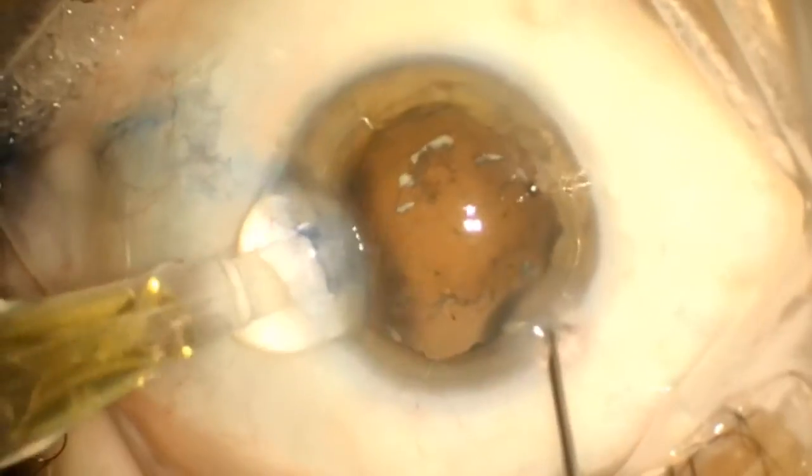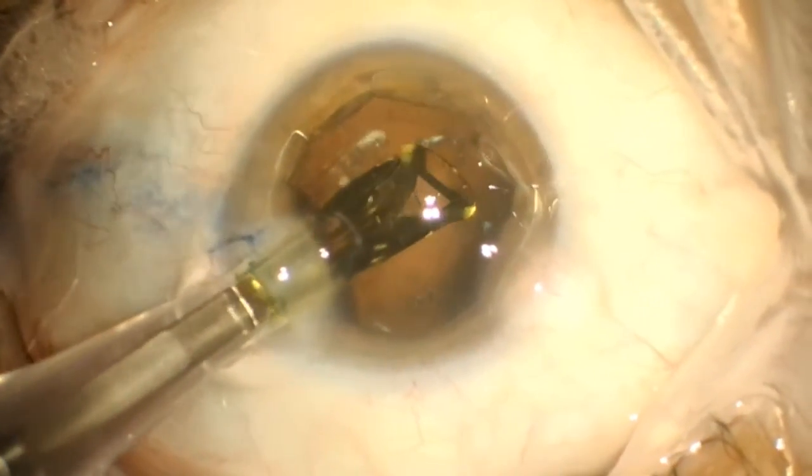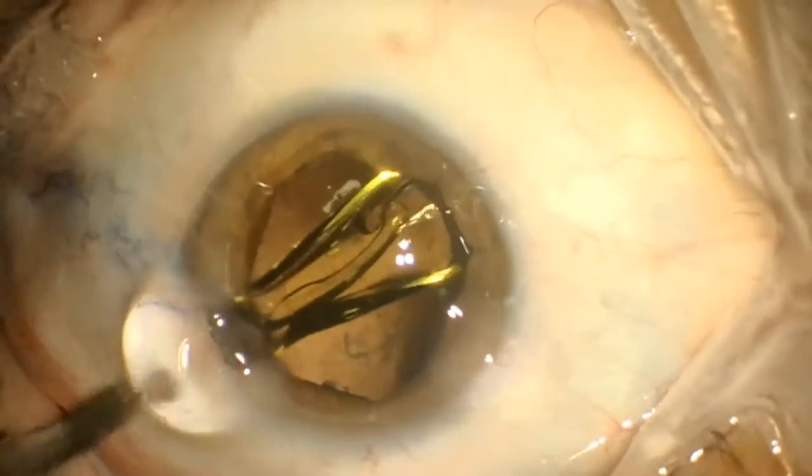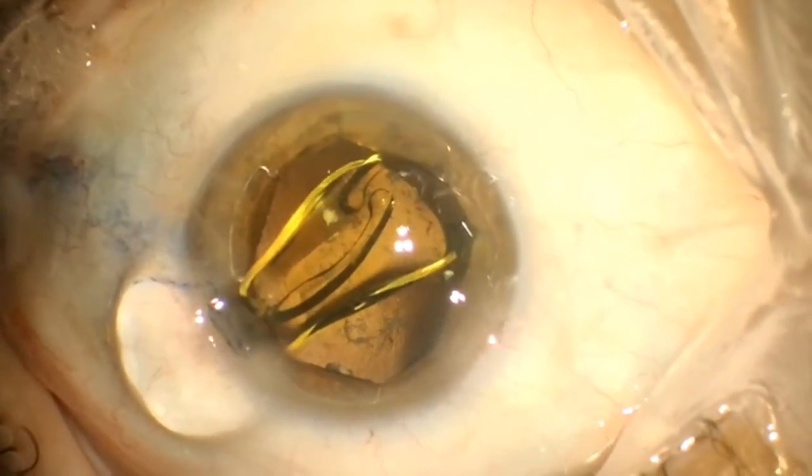After removal of the lens material, the IOL can be placed as normal through the same 2.4 millimeter incision. Once it's secure in the capsular bag, the iris ring can be disengaged and removed.